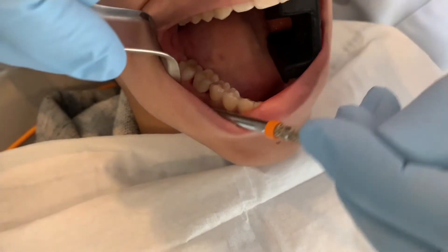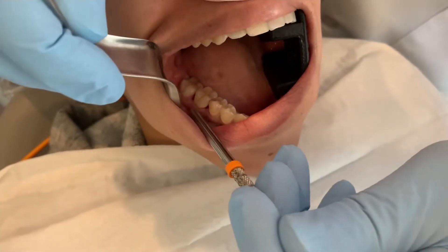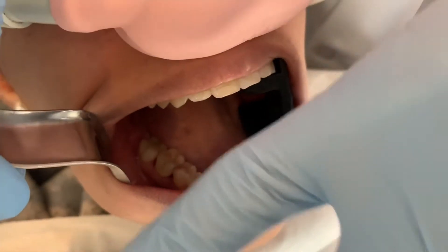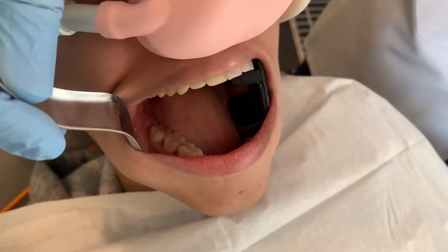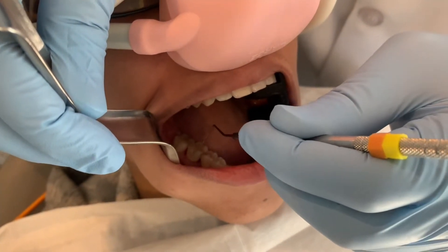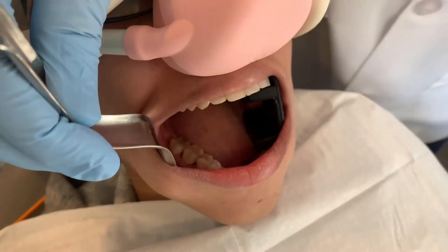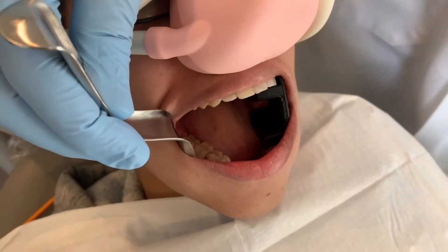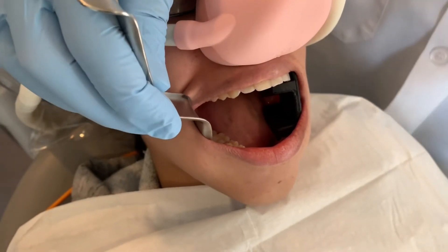We're going to extract the tooth today, treat the site, and you'll see how it works. This tooth right here is tooth number 30. Since this tooth has two roots, I'm going to separate the tooth into two pieces — cut it front to back. Then we can easily take it out like two splinters rather than trying to pull it out in one big piece, which would be much more traumatic.